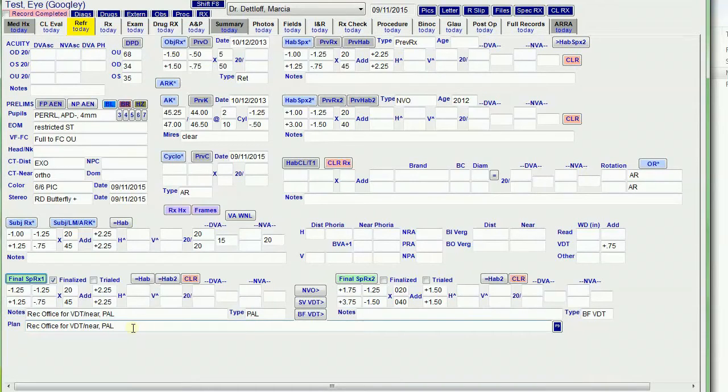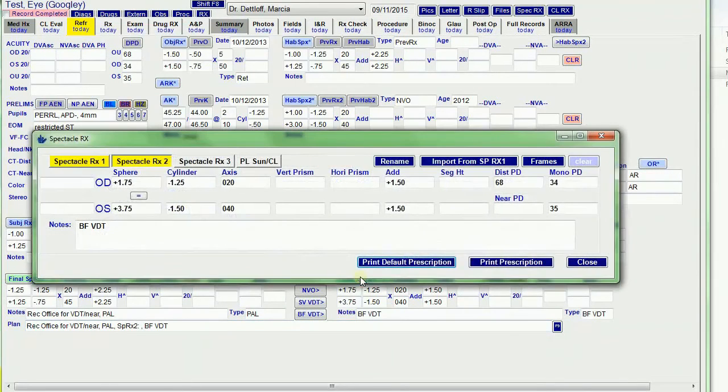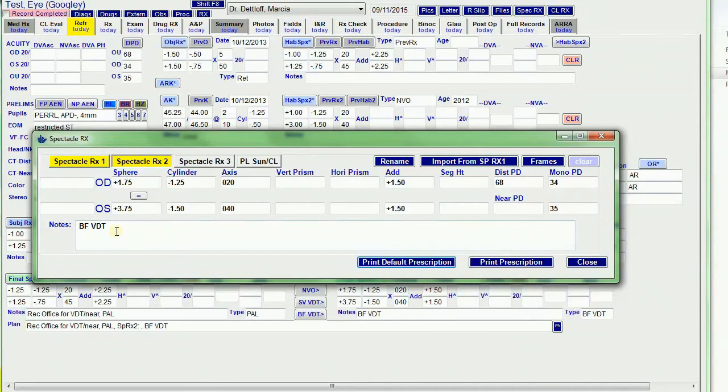So I want to see what's on that A&P tab under the plan, so I keep it here. If I finalize prescription two, it checks the box again. It opens up prescription two. I can rename it if I want. It puts bifocal VDT in the notes.